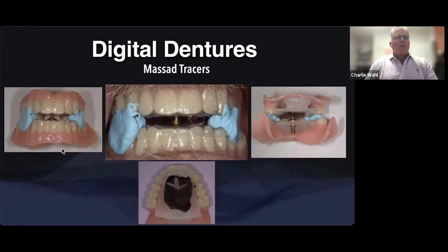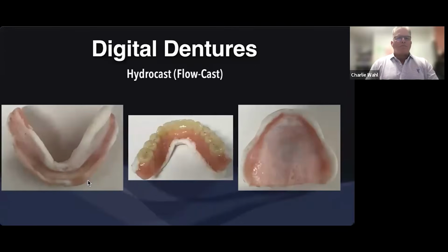So one last point I want to pick out is take a look at the width of his upper arch to his lower arch. Hugely different, right? Obviously, this is a crossbite case. So even not just doing it for tongue space, we need to get these teeth over the ridge. So enormous difference in the size of his arches widthwise.